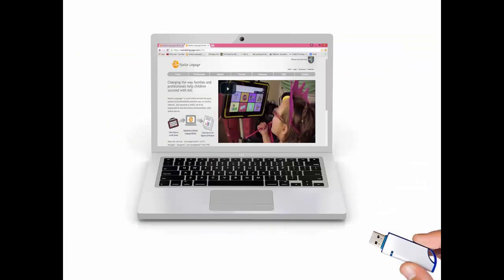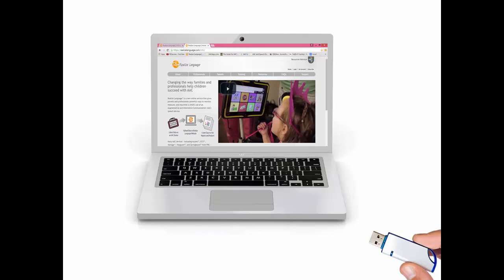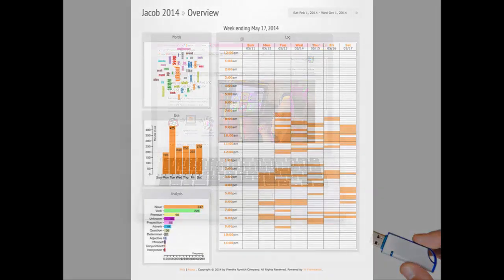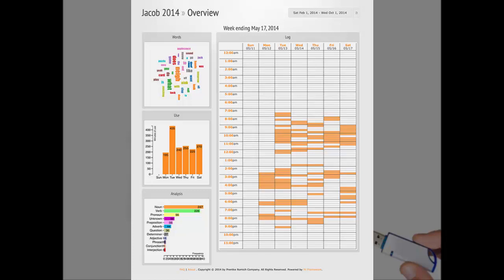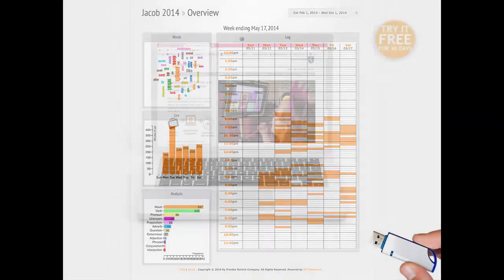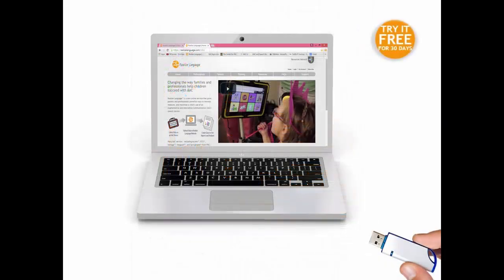To view the data log, unplug the flash drive from the device and plug it into a computer. At this point, if you have an account with Realize Language, you can upload the file to that website. It will turn the raw data file into easy to understand pictures and graphs. Please know there is a 30-day free trial.